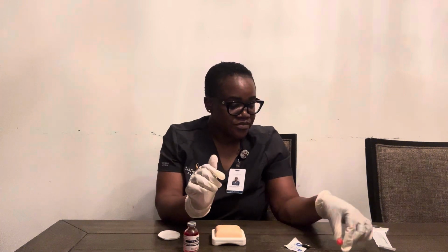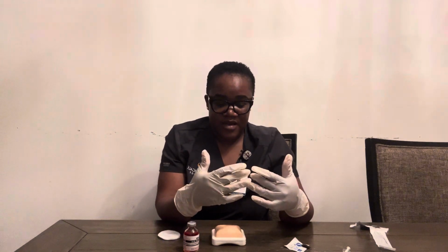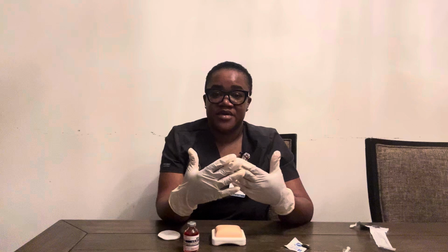Okay, so the next thing that I'm going to do, I'm going to select my site for my PPD test. And for this site, I'm going to select the inner forearm, about 3 to 4 fingers width below the antecubital space, or 1 hand width above the wrist, or anywhere on the inner forearm. And then you could choose either site. If there's no acceptable site on the arm, then we could check the upper back.